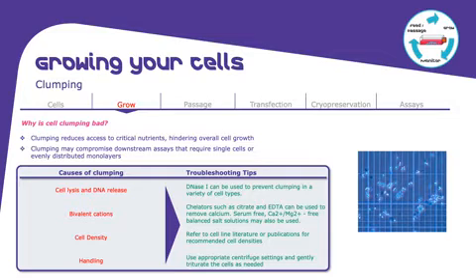Cell density is also very important, so check publications or literature for the recommended cell density. And also the handling of the cells. It is very important to use appropriate centrifugation settings and also to work gently with some of the cells.